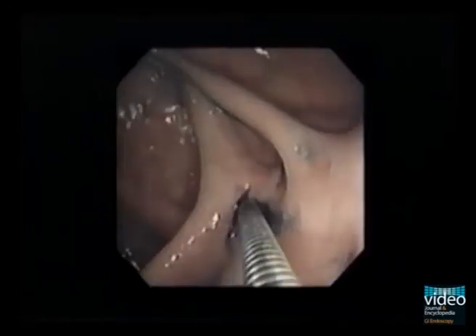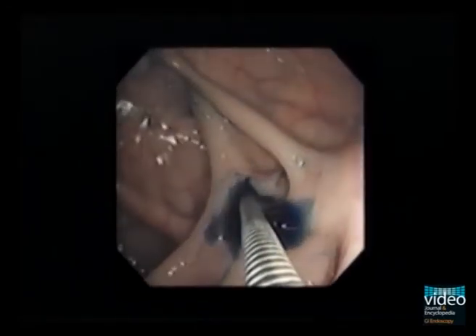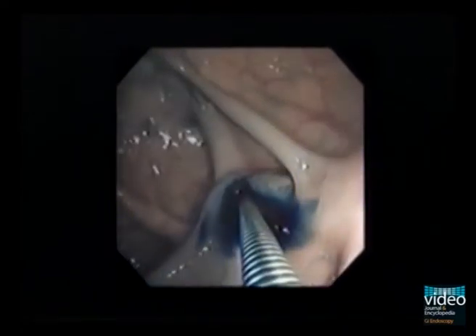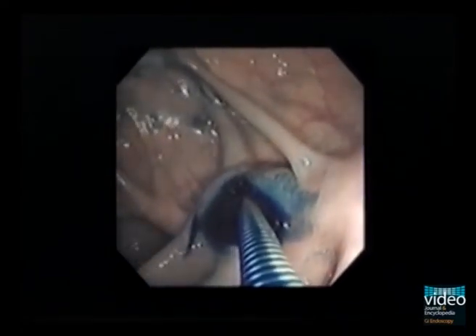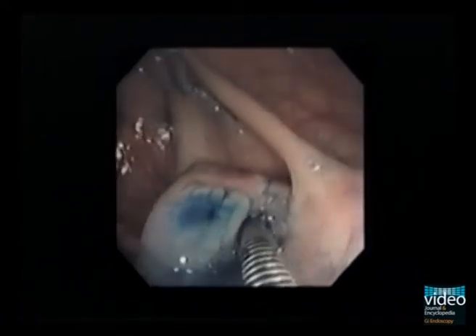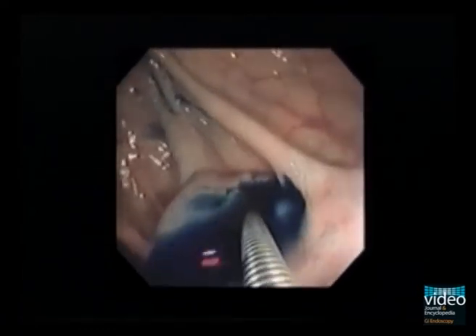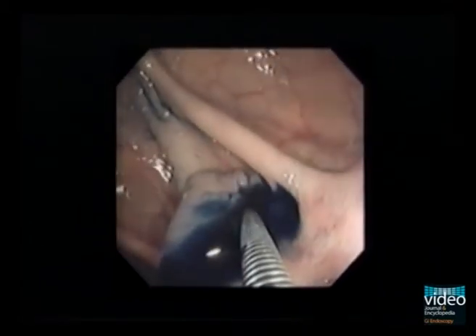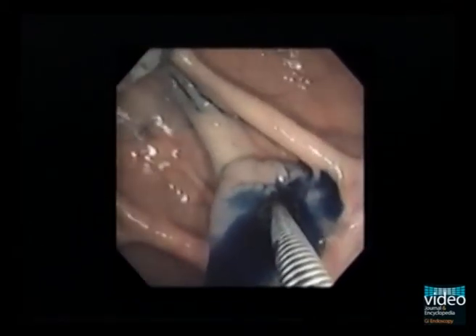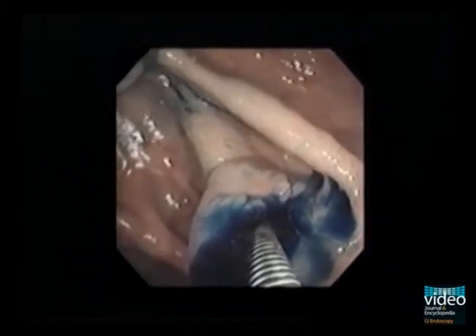This is another case with a flat-type tumour suspicious for an early colorectal cancer. First, enhance demarcation of the lesion by some dye spraying, then inject fluid into the submucosal layer next to the lesion. The lifting sign of this lesion is positive, and we can proceed with endoscopic resection. The resection specimen showed a depth of invasion of 400 micrometers.